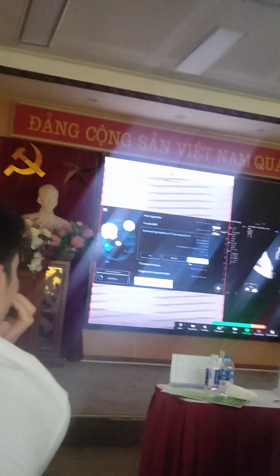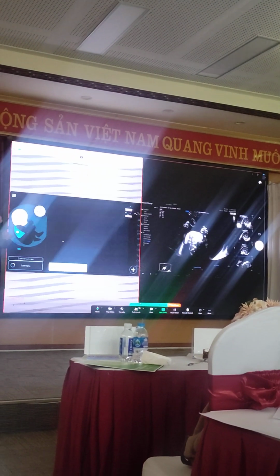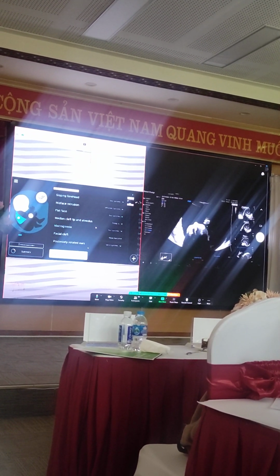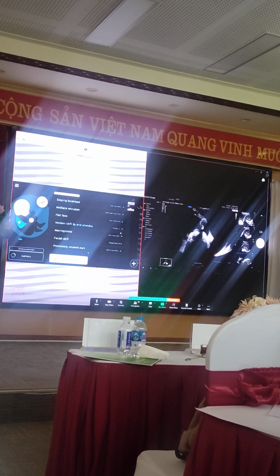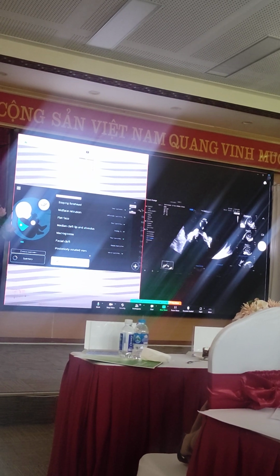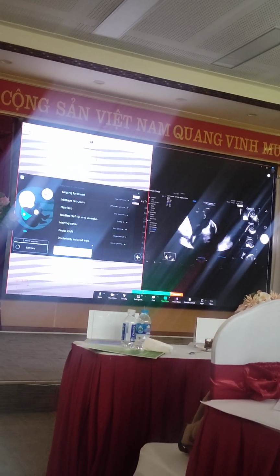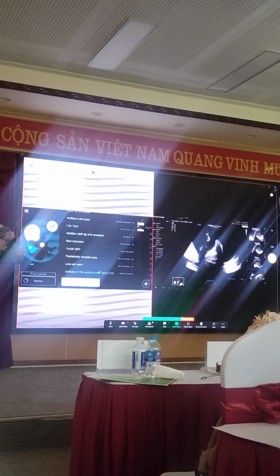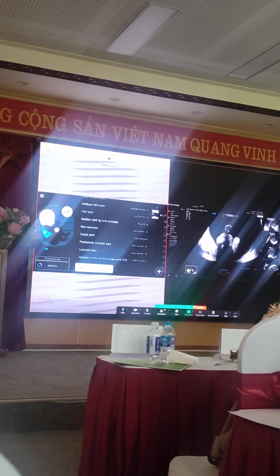You should look at the palate, and you should look at the nose from underneath. The nose from underneath, you need color Doppler, because you're going to look at the choanae. Because in CHARGE syndrome, the atresia of the choanae is quite a constant finding of at least one choana. So you look at the flow in the nose. So you need some low flow Doppler.